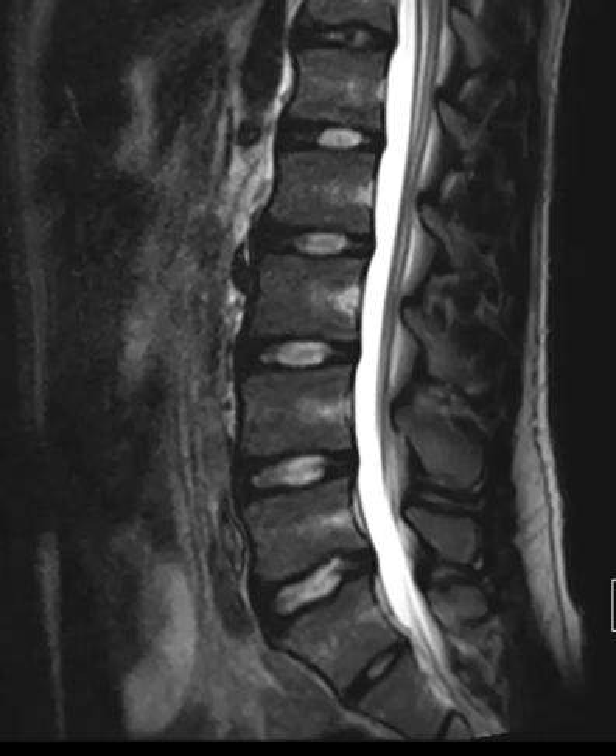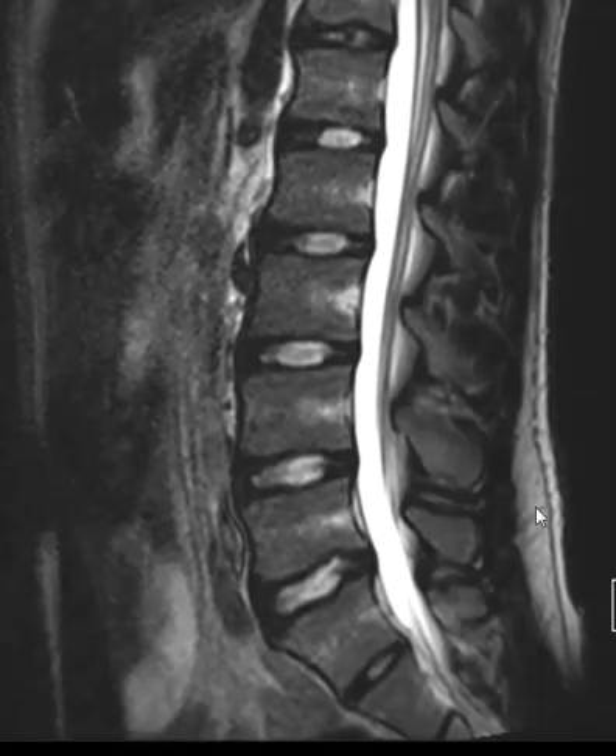Hello, this is Dr. Gay from First Sick MRI. This is a 17-year-old male who is an athlete with chronic back pain. This is an example of a stress fracture. These are not terribly uncommon and they're usually in younger people who do really strenuous things like rowers, sometimes football players, or people who do gymnastics.